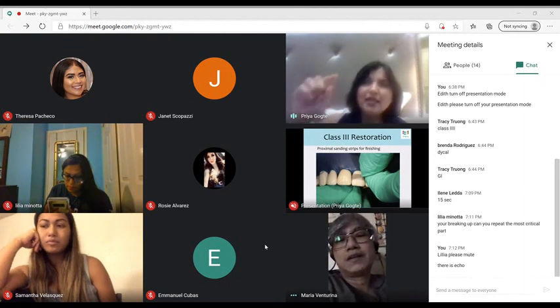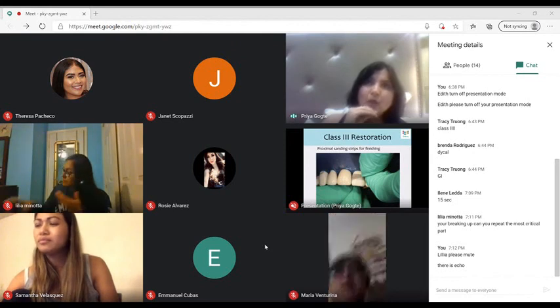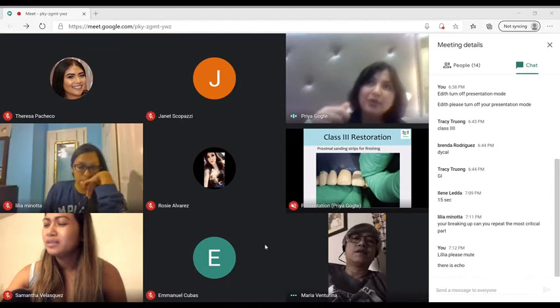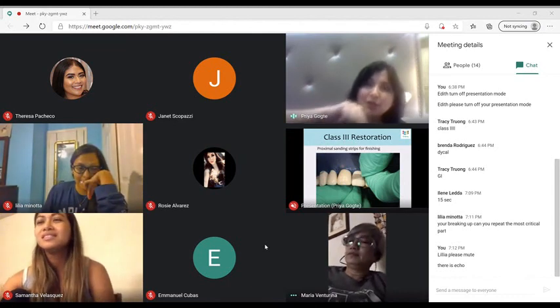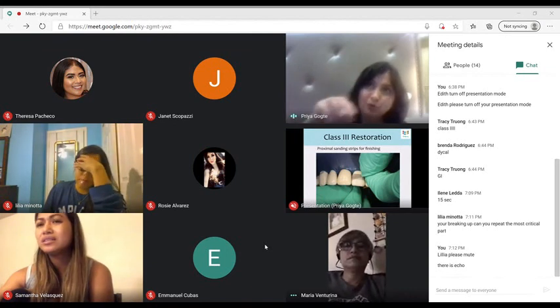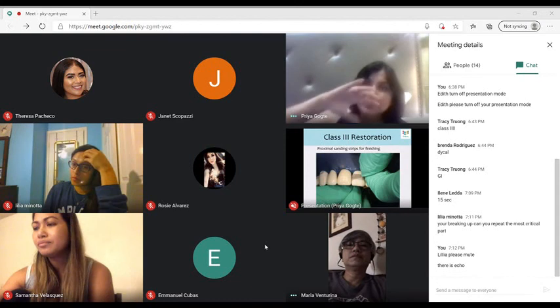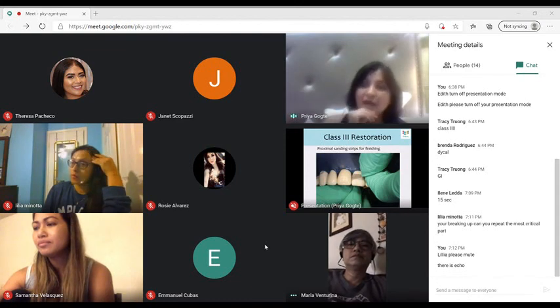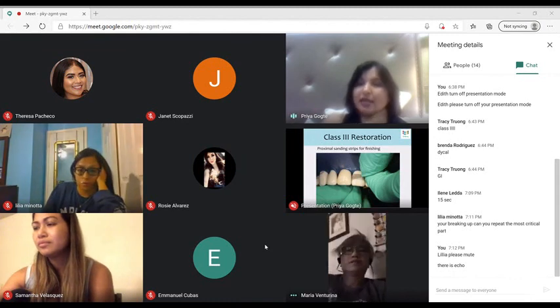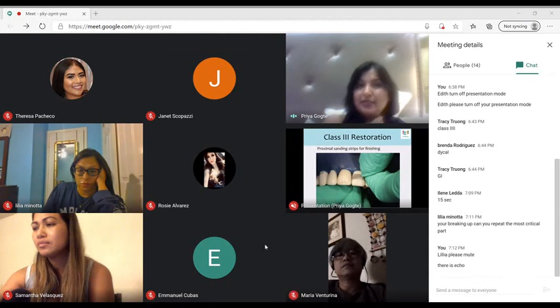Yeah, and it goes into the proximal areas pretty well. Like it will go into the gingival floor and all those areas pretty well. With the bulk, it's sometimes harder to push it in every area. That's why I feel like the flowable flows well, and then when you push the bulk, all the areas are covered pretty well. I'll do it tomorrow, and then you guys can see how I do it.